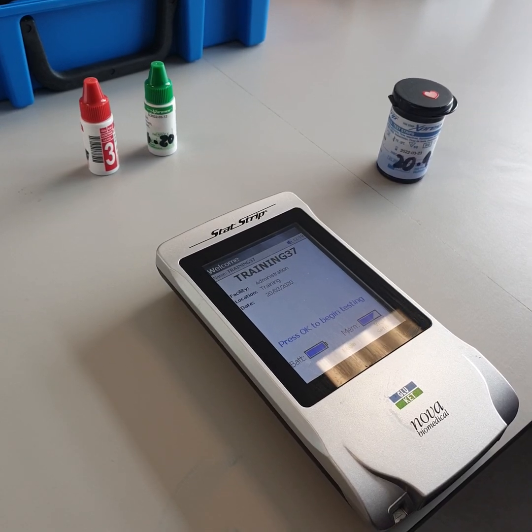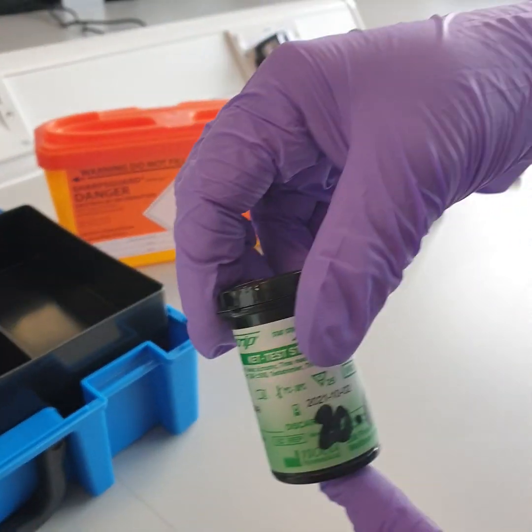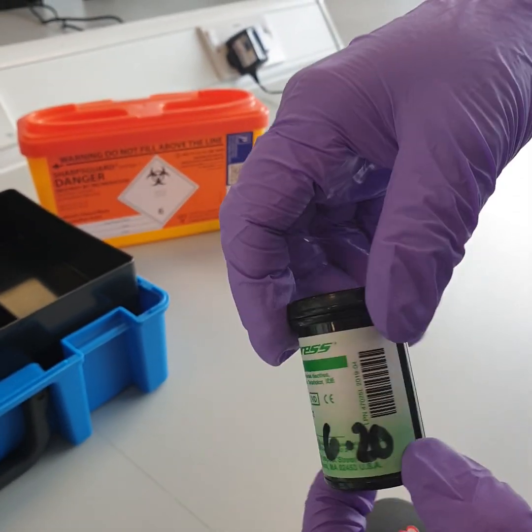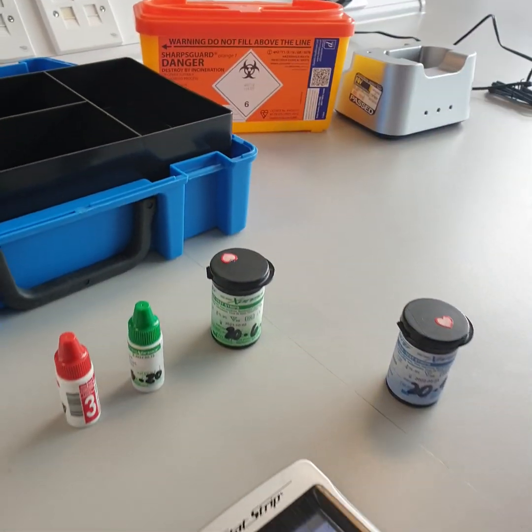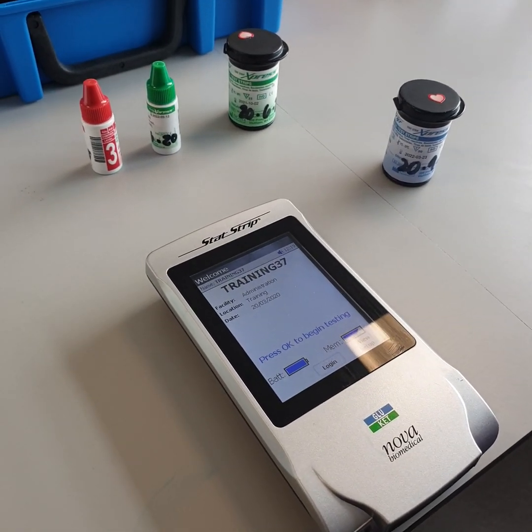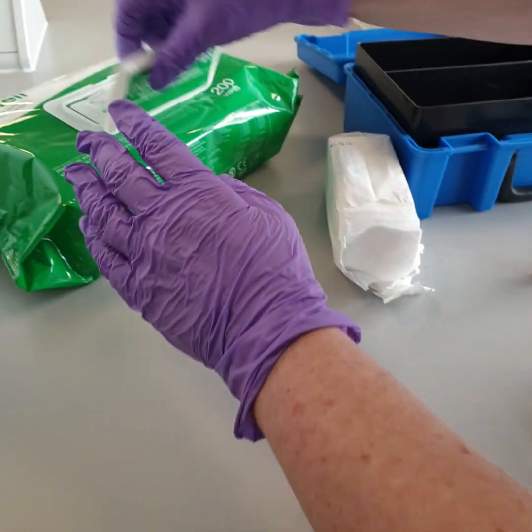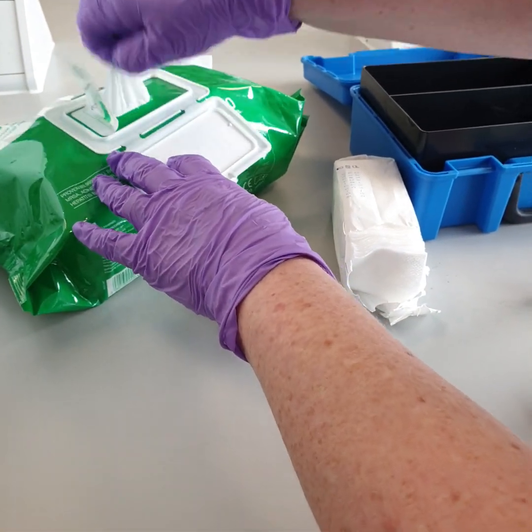QC testing for ketones is done following the exact same steps, but you use ketone strips instead. You need to familiarize yourself with the ketone testing procedure for your department and how often you need to QC the machines for ketones. Clean the meter with disinfectant wipes and store it back in the docking station.